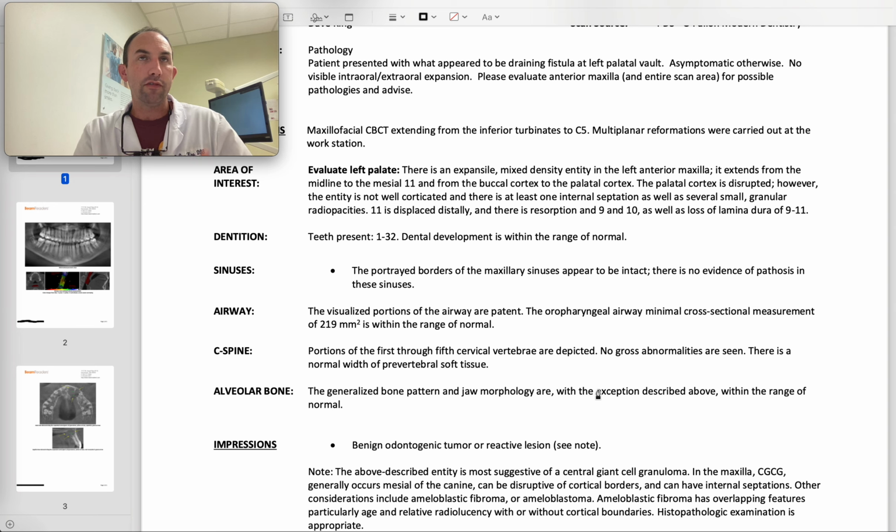So taking a step back, I would suggest for any new patient that's older than 18, given the need, to take a full 3D scan. Because if you end up diagnosing periodontal disease and you get insurance pushback, where they say you don't have periodontal disease or they don't want to pay your claims, one of the last triggers we can pull is having an oral and maxillofacial radiologist review that CBCT and diagnose alveolar bone loss. How is the insurance going to turn it down if you have an oral and maxillofacial pathology radiologist review a 3D x-ray that indicates bone loss? That's kind of a slam dunk.